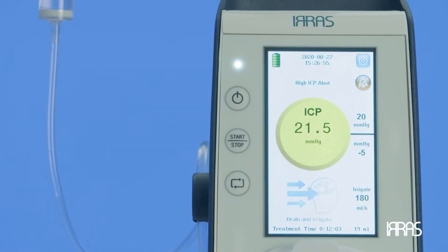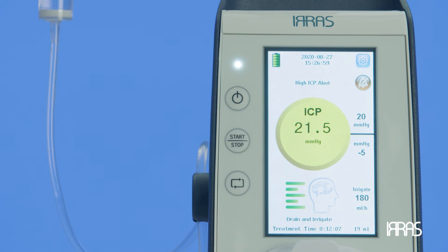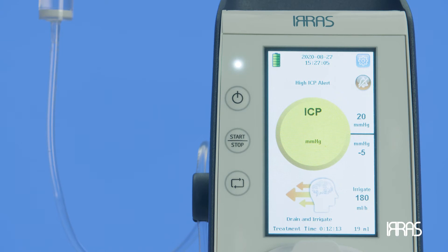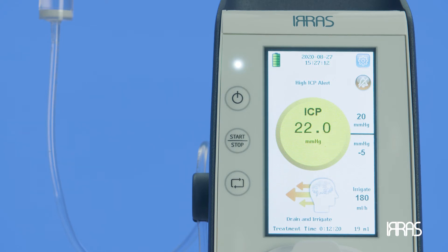High ICP Alert. If you experience a high ICP alert, it means the ICP value has increased one to three millimeters of mercury or centimeters of water above the high ICP alarm. The control unit will alarm and the ICP circle on the screen will be yellow. The control unit will continue to function as intended but will be alarming.